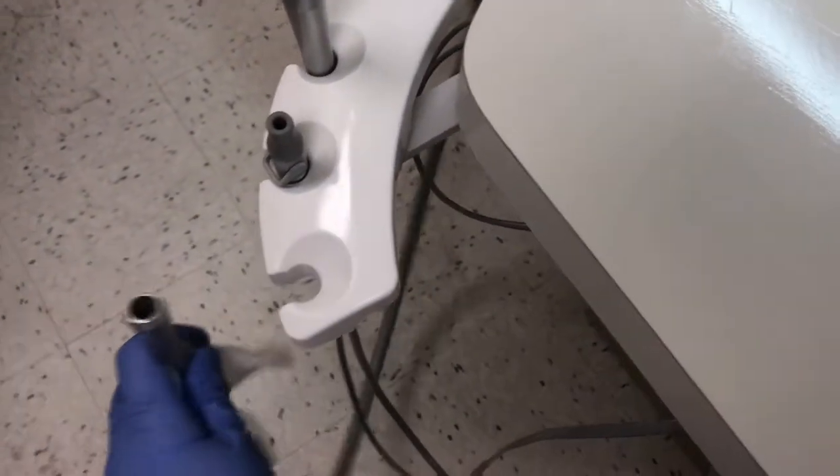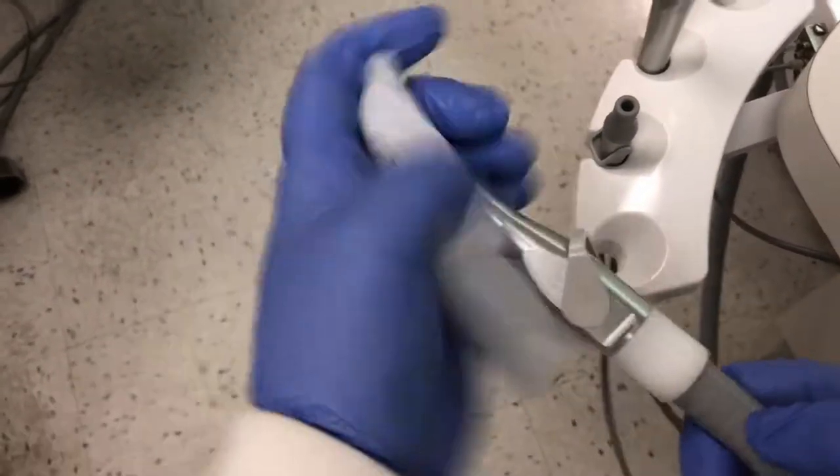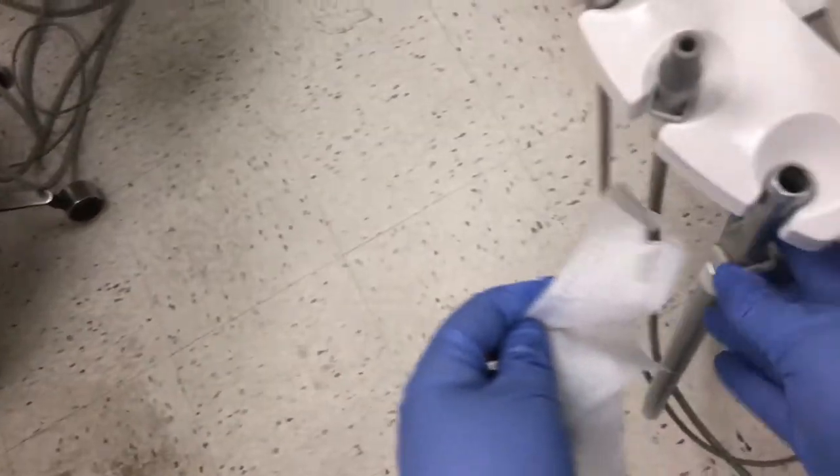Every clinical surface needs to be wiped down. Make sure you carefully disinfect each and every piece of equipment. For the assisting side, make sure you take the equipment out of the holsters and carefully wipe down the hoses. Also take time to wipe the holsters.